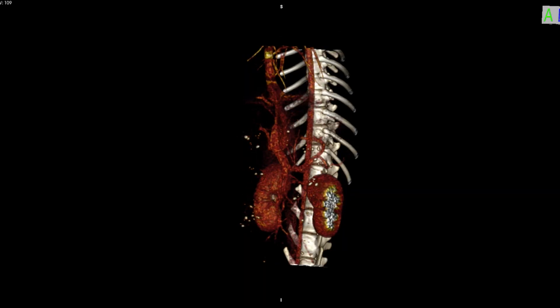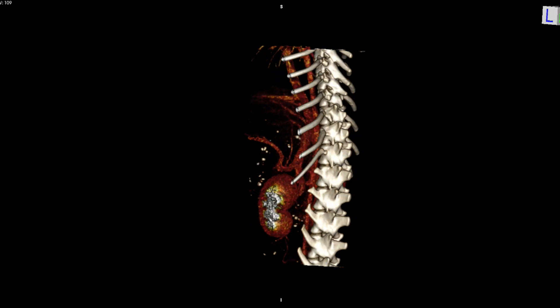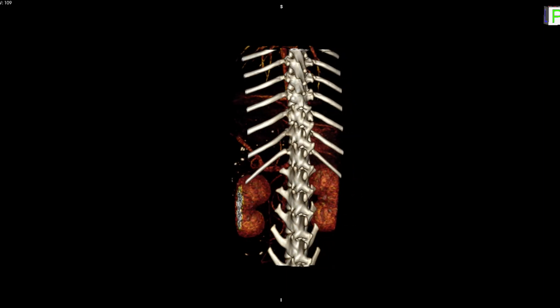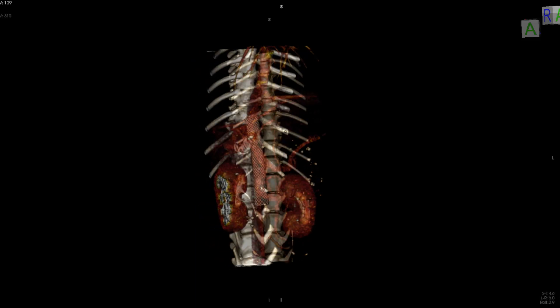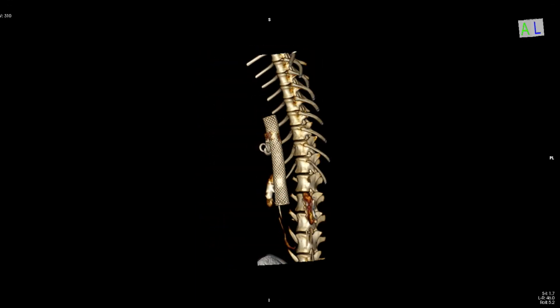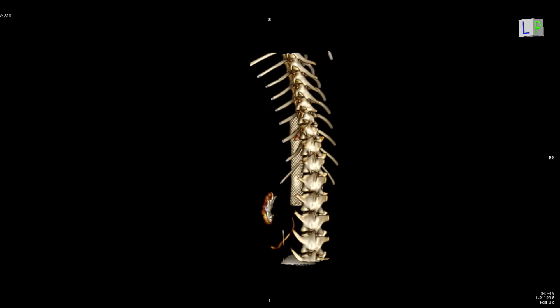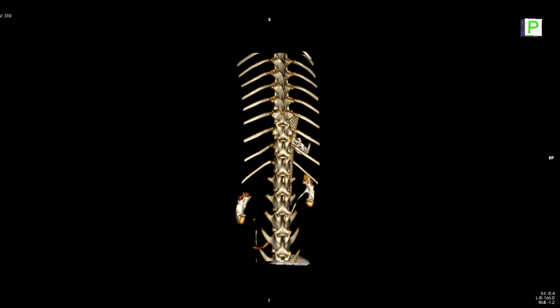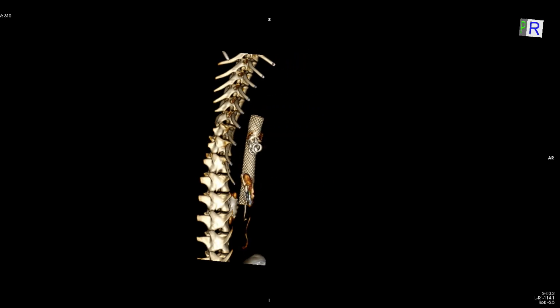Pre-op 3D volume rendering shows the portosystemic shunt in place, and then post-operatively we can see where we've placed the stent and the coils into the shunt, as shown here.